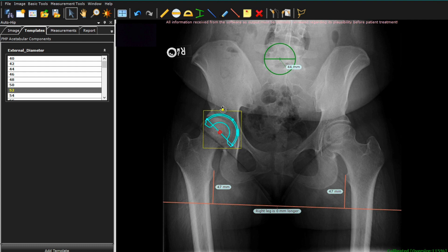I've selected 52 in this case and we will now size this. When I size the cup, what I'm looking for is good fit with the inferior border against the inferior edge of the teardrop, and the cup flush up against the iliaceal line. I will also look at the position of the cup in relation to the femoral head, and sometimes in larger males the cup will actually be a little bit down below the teardrop.